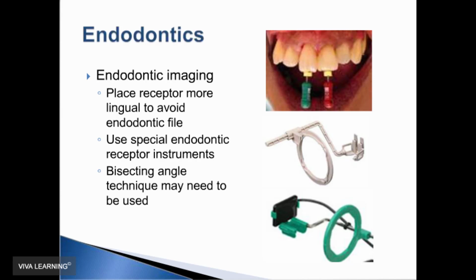If you are using a hemostat or some other device, like a snap array that's designed for a digital receptor, then it's very important to be familiar with entry points on the face. And then just very briefly, that will help you align the central ray to the center of the receptor.